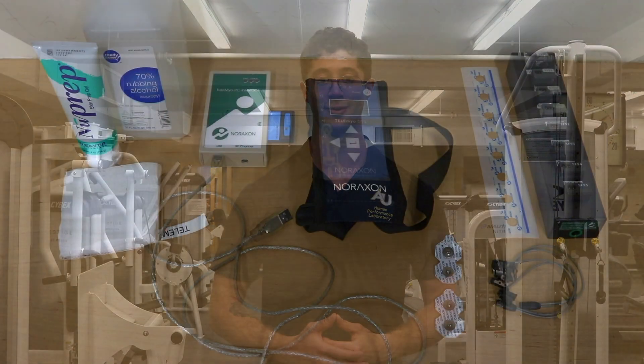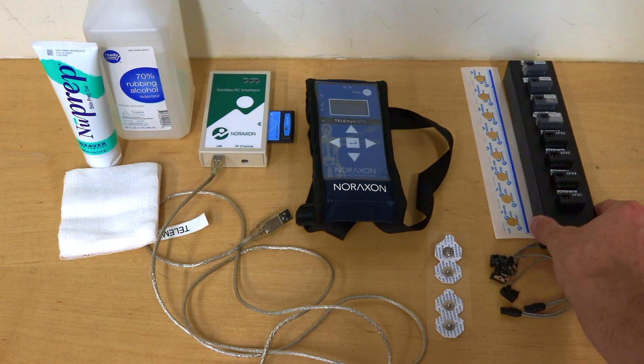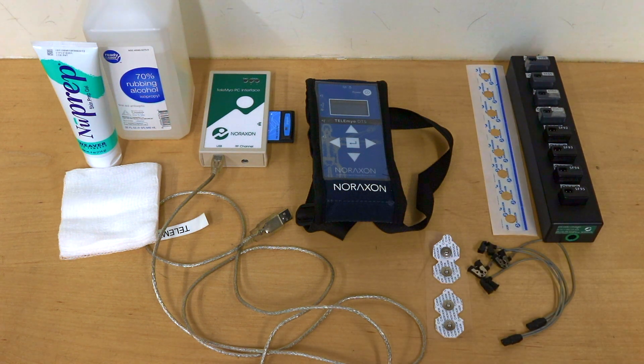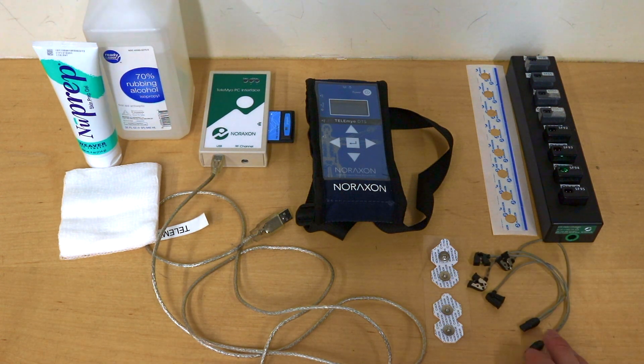Without any further hesitation, let's get started. Before we can get started we need a few things: our charged EMG electromyography sensors, sensor stickers which will allow us to stick the sensor to the individual, and electrodes — dual hex electrodes that connect specifically to EMG applications.